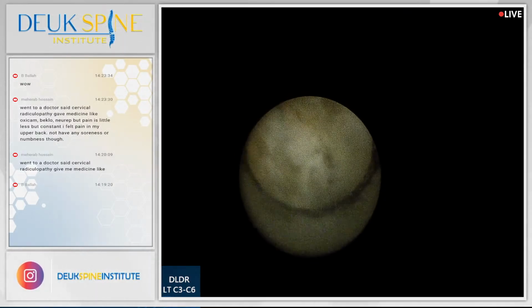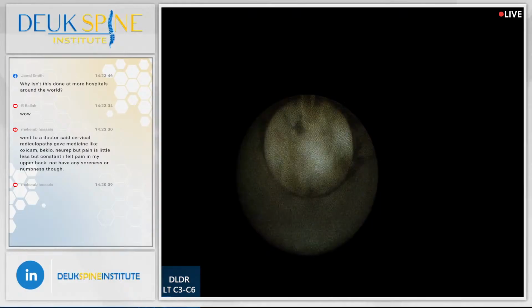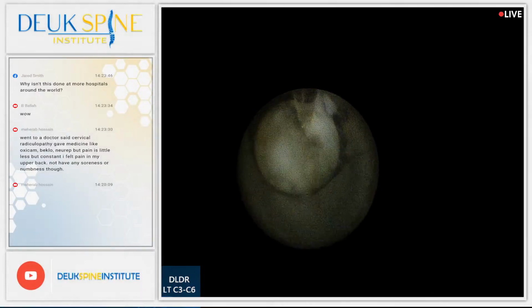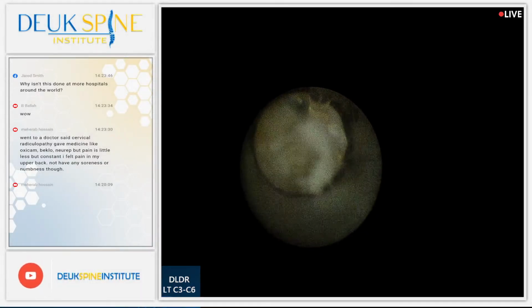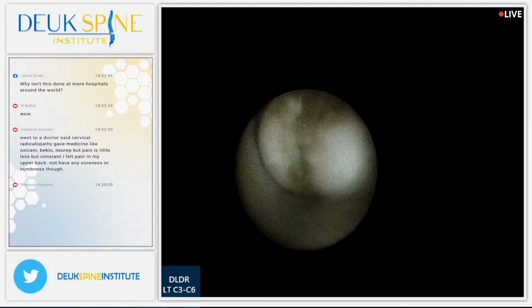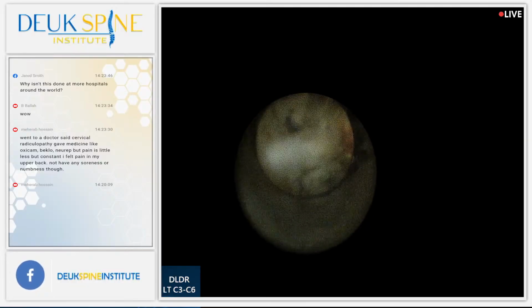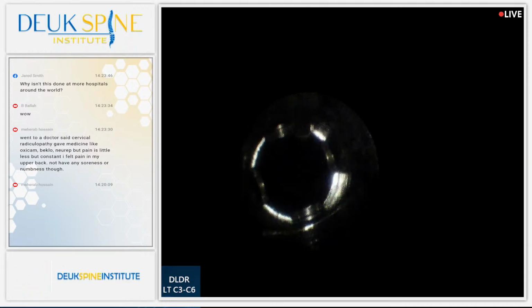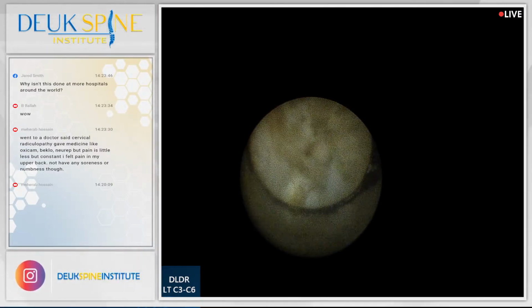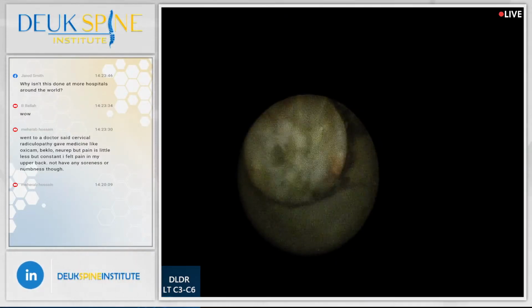These, which fibers are these? This one is the cheapest. Maybe that's the problem. We need to do a side-by-side comparison, because if the fiber is not transmitting the laser energy through it, you know? Yeah, when I order, we tested. The technician has a test for the power that comes through the laser fiber, and that's why we started using this one, because I started comparing with the other one.